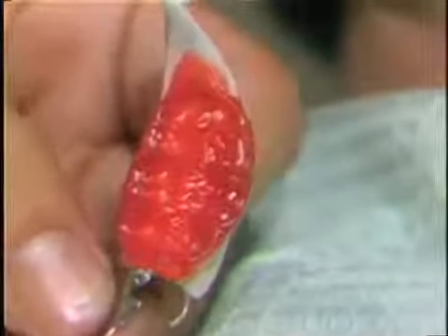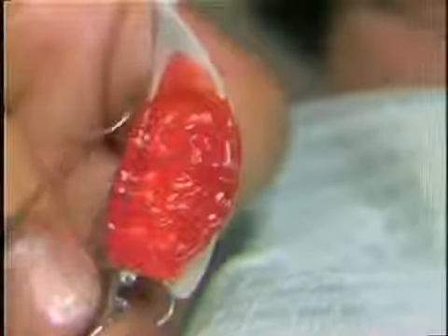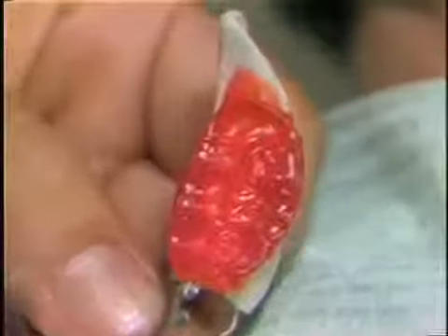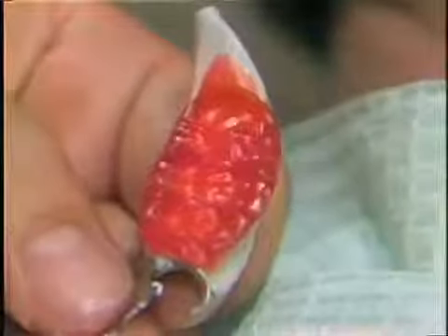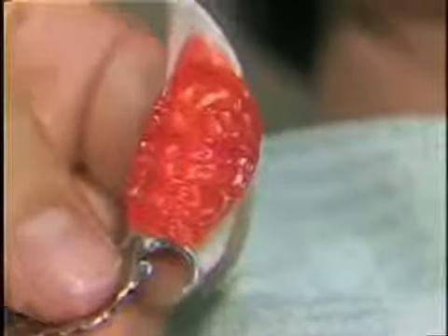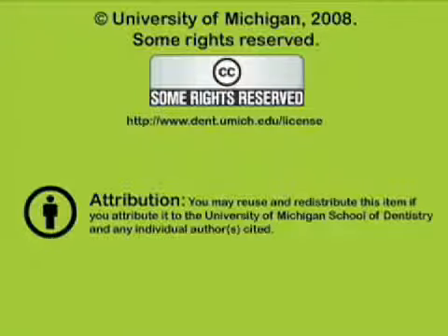But if you were just to use this and to pour a positive of this negative that she has given us, you would have a perfectly balanced occlusion. But this is a functionally generated path from the patient, and all the dynamic movements incorporated with mandibular movements are incorporated into this product.